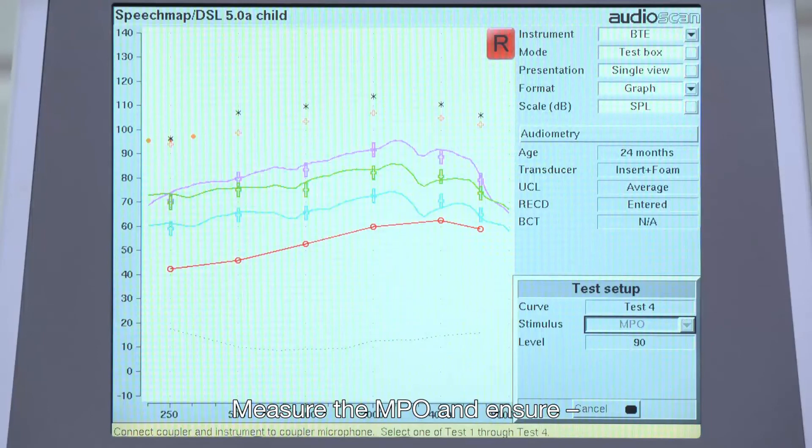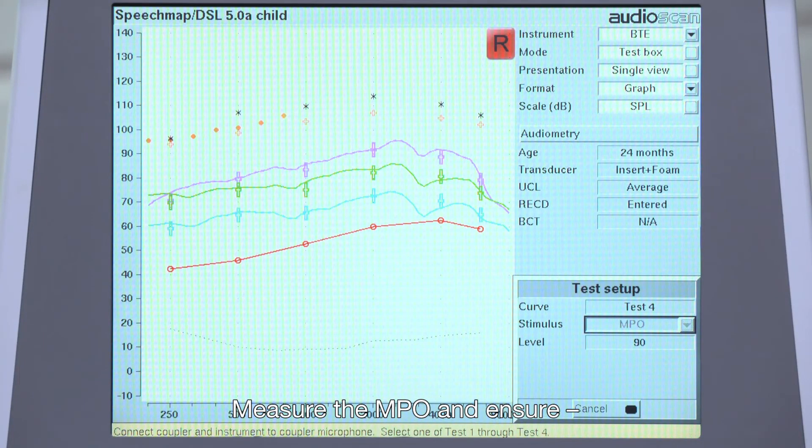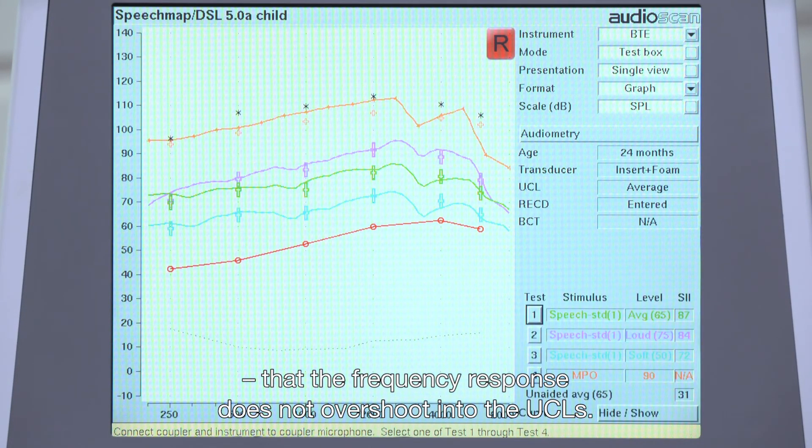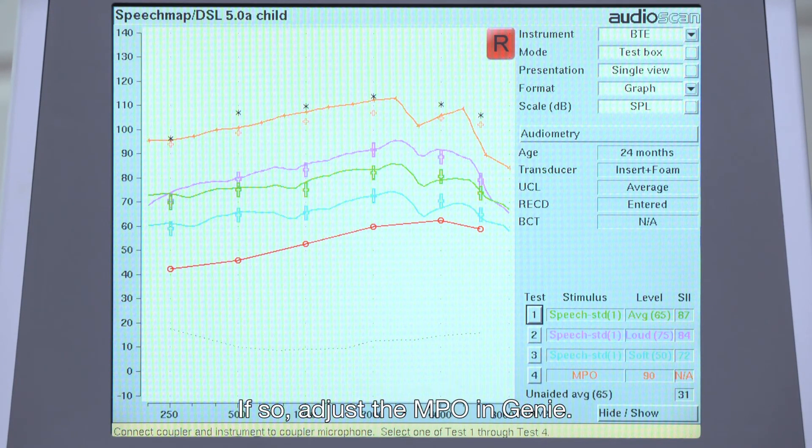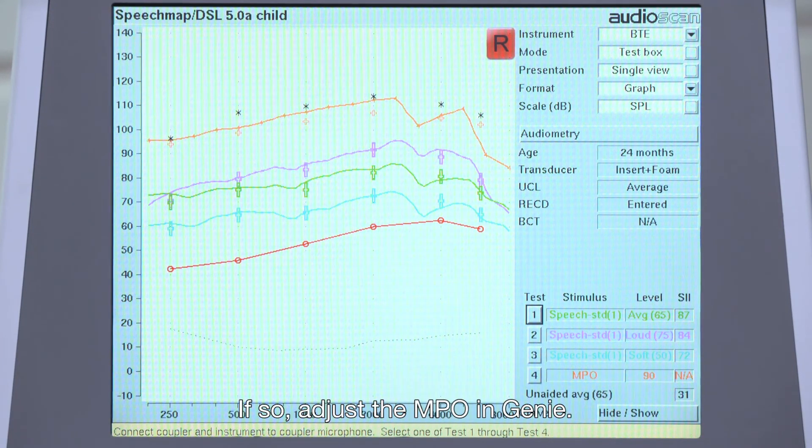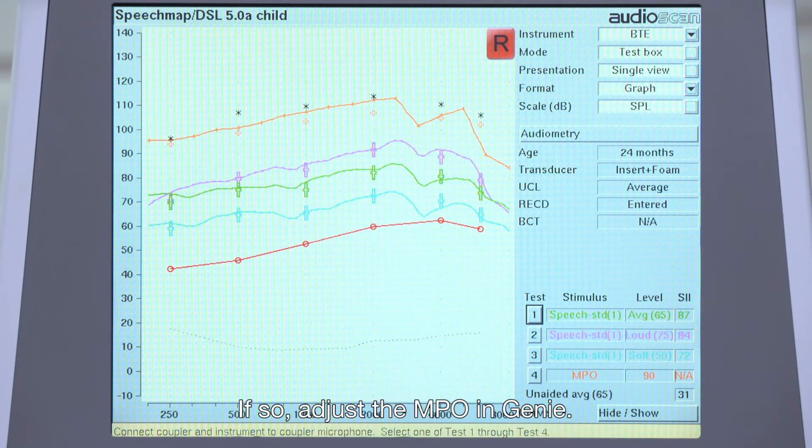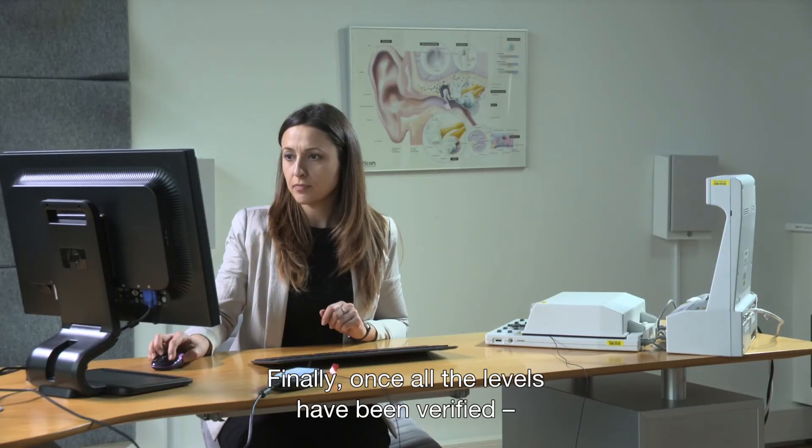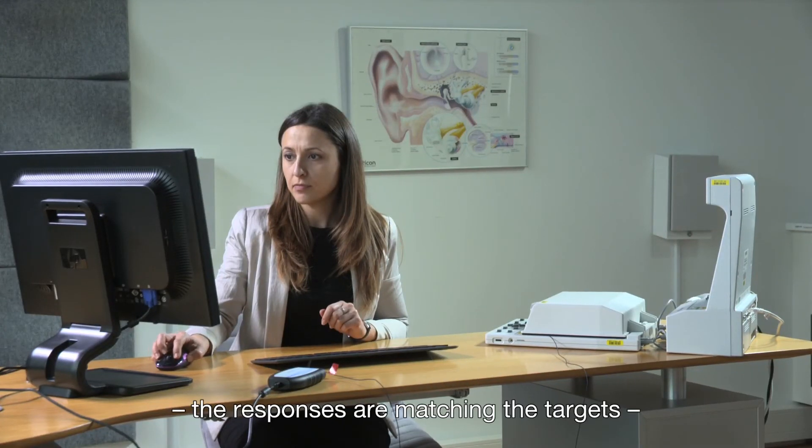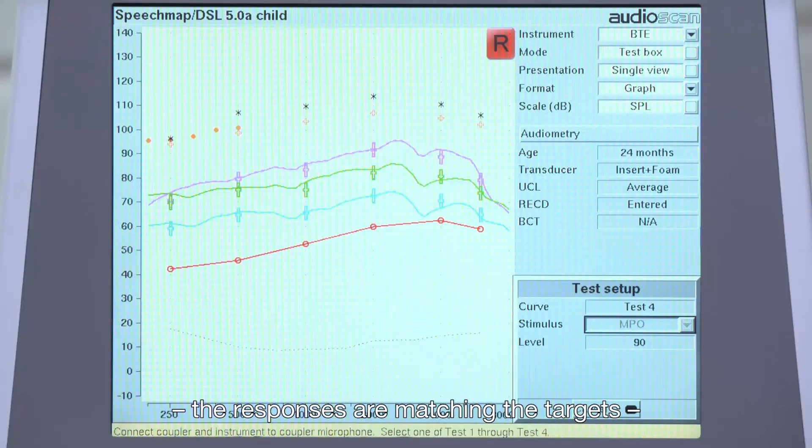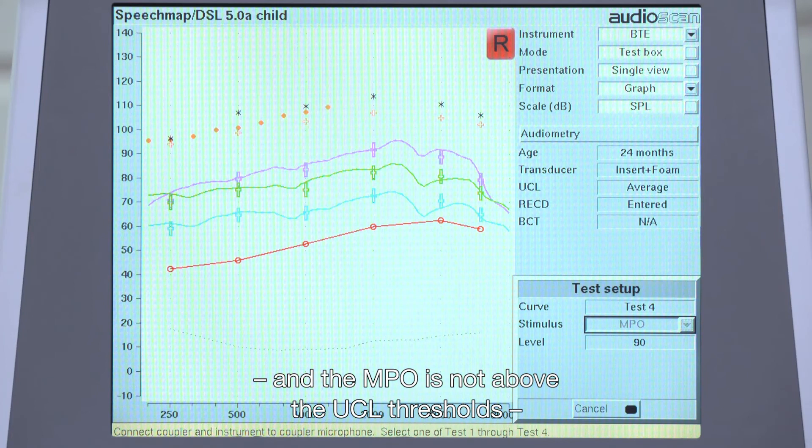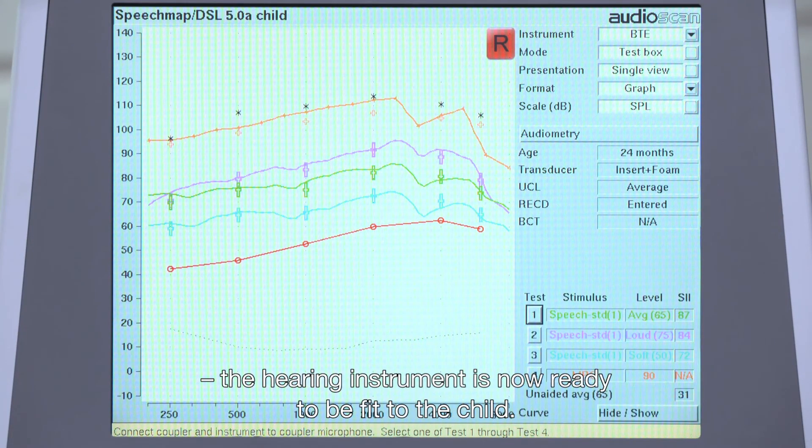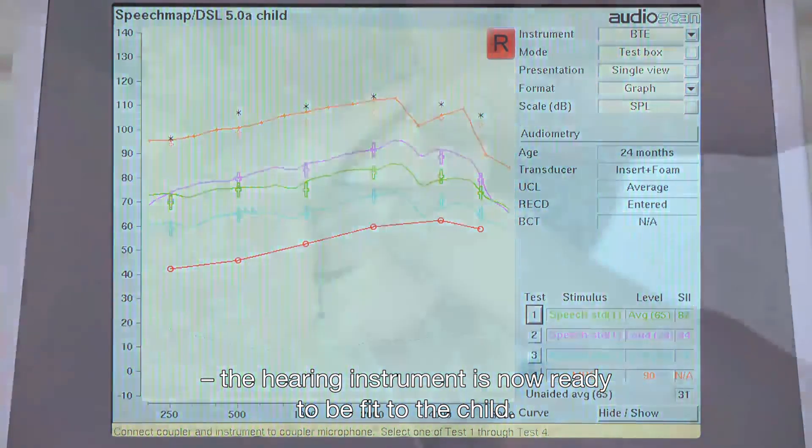Measure the MPO and ensure that the frequency response does not overshoot into the UCLs. If so, adjust the MPO in Gini. Finally, once all the levels have been verified, the responses are matching the targets and the MPO is not above the UCL thresholds, the hearing instrument is now ready to be fit to the child.